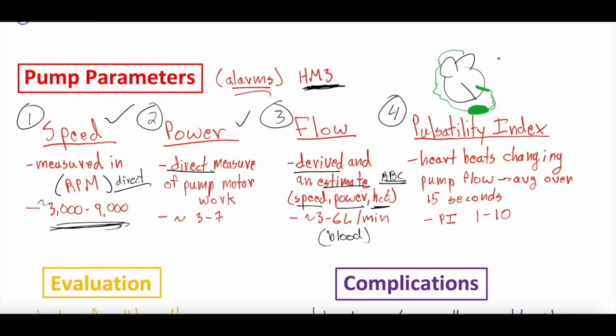And we'll draw the aorta here, which comes out of the left ventricle into the aortic arch, into the descending aorta, the rest of the body, right? And then this outflow tract has its big cannula going into the aorta. But that heart is still beating. There's still native beats going on.